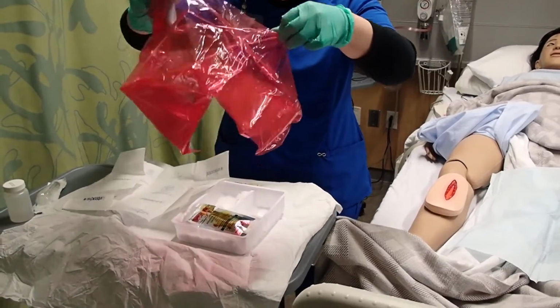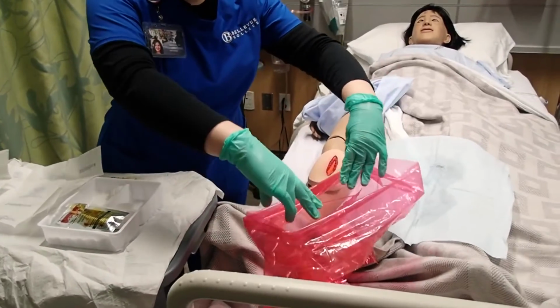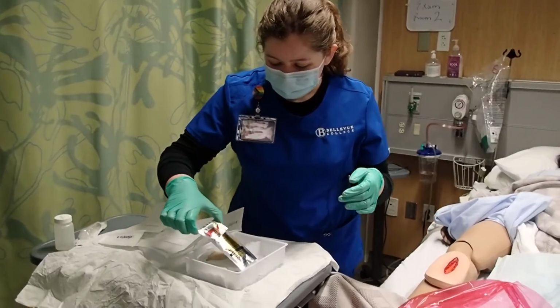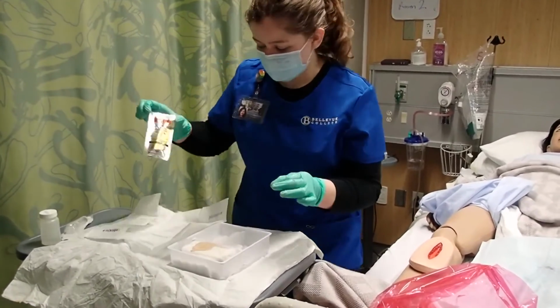Everything is sterile in this package. I have my biohazard bag. I'm going to discard of these because I'm going to use saline to clean.